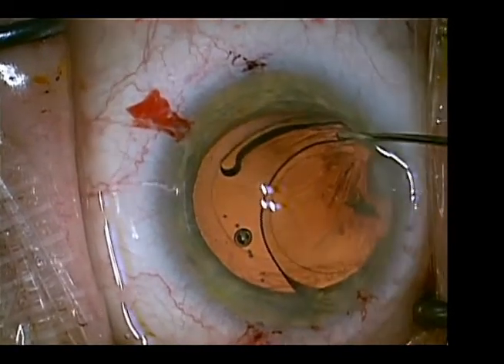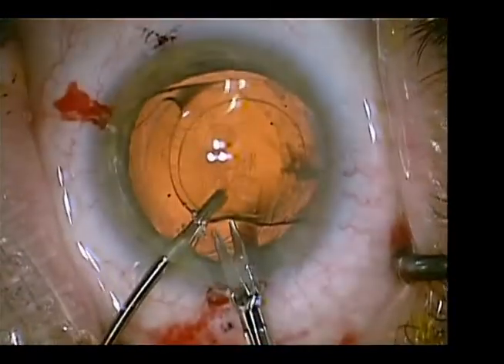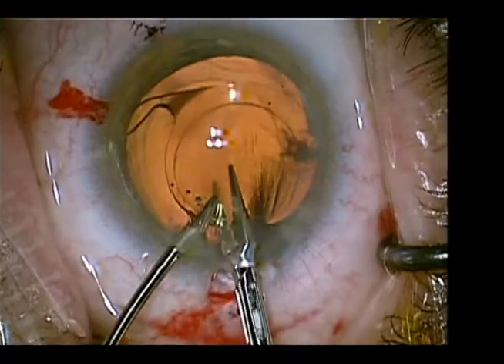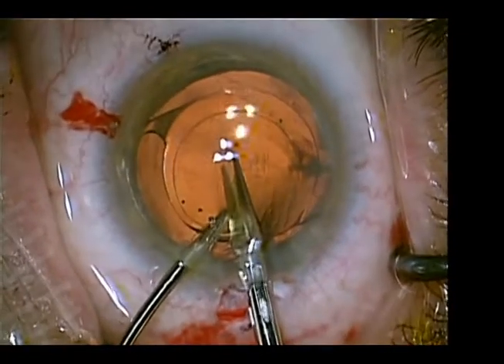Interestingly, the superior loop shows very little in the way of adhesion to the capsule.